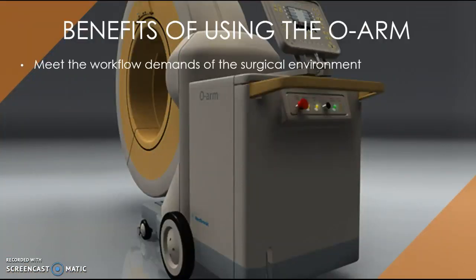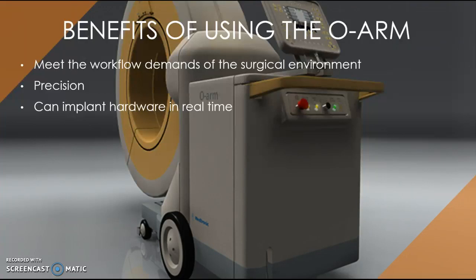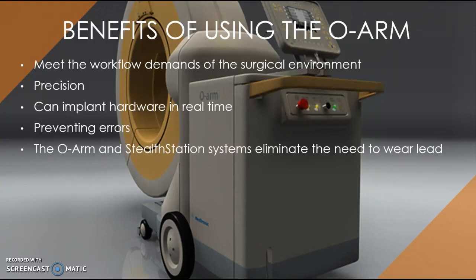The benefits of using the O-arm. They meet the workflow demands of the surgical environment. You have your C-arm portion of the O-arm, and you also have your 3D scanning. It allows for surgical precision. They know exactly where they're putting in that hardware. The hardware that you're putting in is in real time. It is exactly how the patient is laying, which prevents errors.